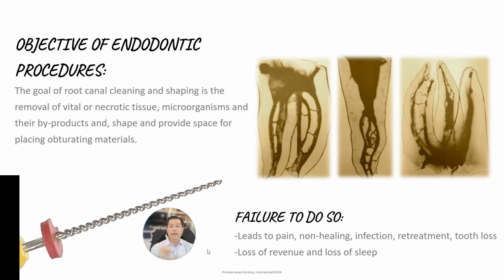And when you do a root canal, endodontic procedure, non-surgical, it is not easy to do. But when I obturate, that is like the icing on the cake. We're fully committed, right? Either I have the canal cleaned out or I don't, and I don't know. Now, with the file going down those main canals, let's say I have a single rooted or single canal tooth, and I have one canal, and I take my file and I'm going up and down.